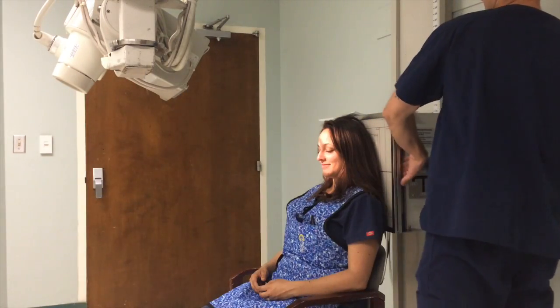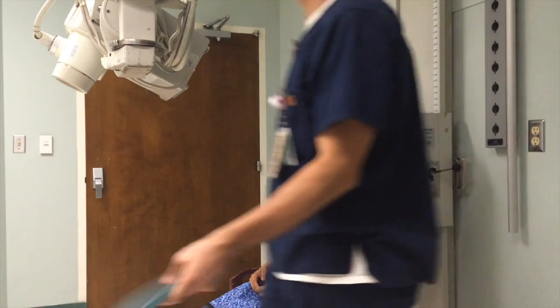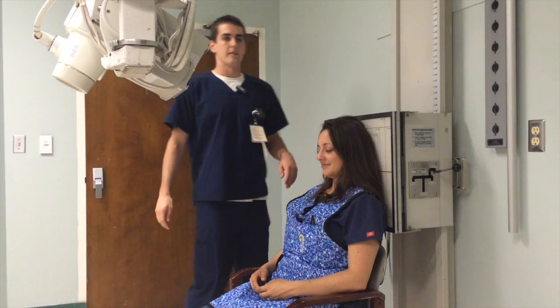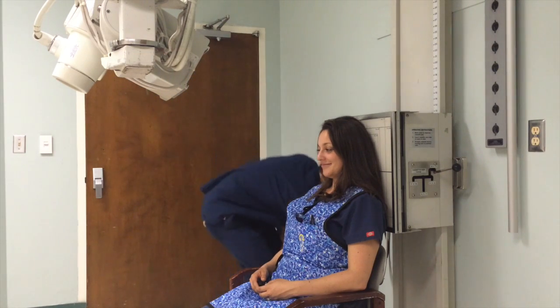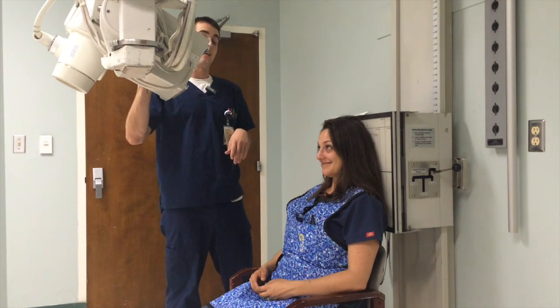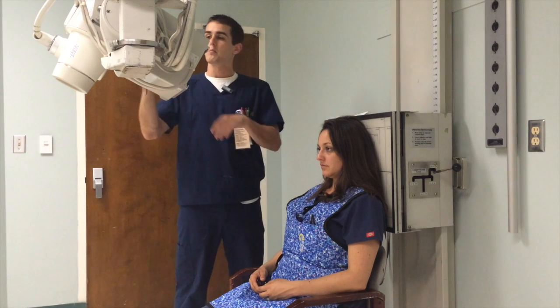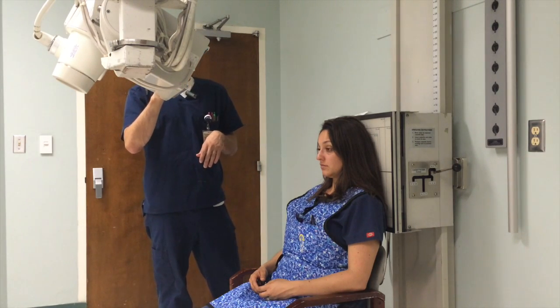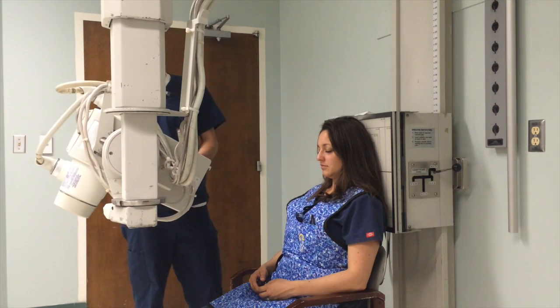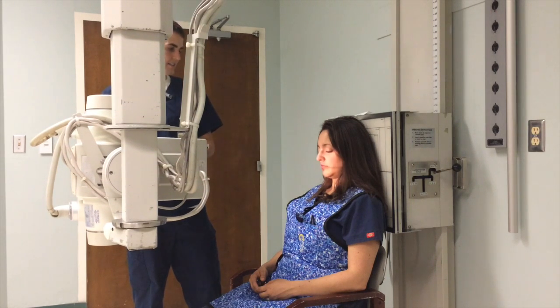We're going to do our next view. Switch out our IR. We're still using a 10 by 12 because our hospital does not have 8 by 10s. Otherwise, we would use an 8 by 10. So the next view is going to be our SMV. So we're going to get the OML parallel with the IR this time, but we are going to have a horizontal beam. So we're going to lower this down. It's lined up. Close your eyes.